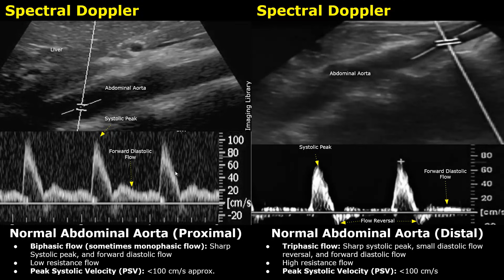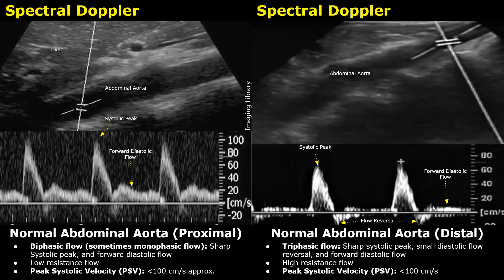The peak systolic velocity in the aorta is usually below 100 cm per second approximately. In the distal aorta, as we go down towards the umbilicus, we will find a triphasic flow on spectral Doppler. It is present in the aorta below the renal arteries. The waveform has three components: a sharp systolic peak, followed by a small flow reversal, and finally a forward diastolic flow.